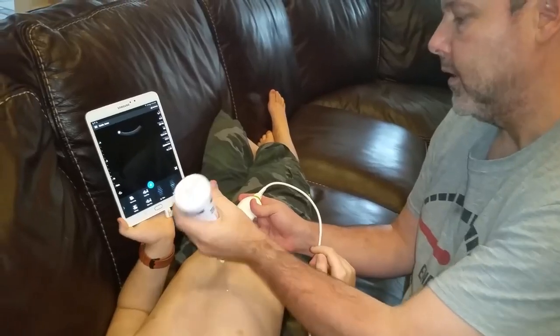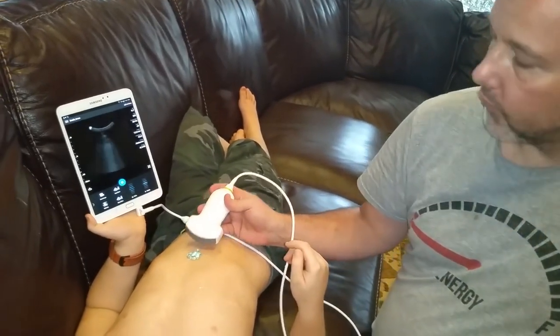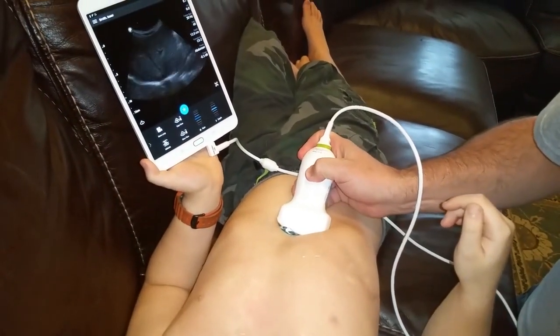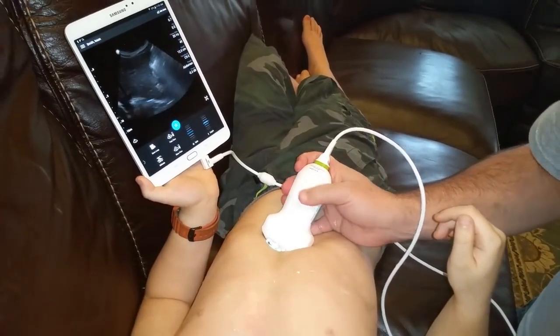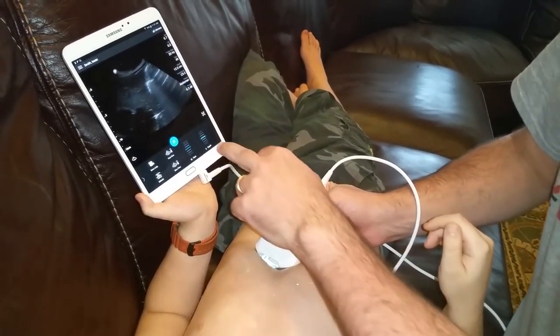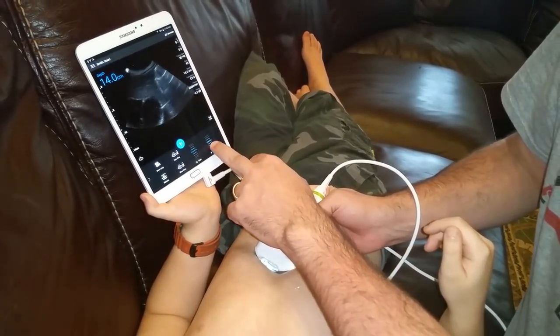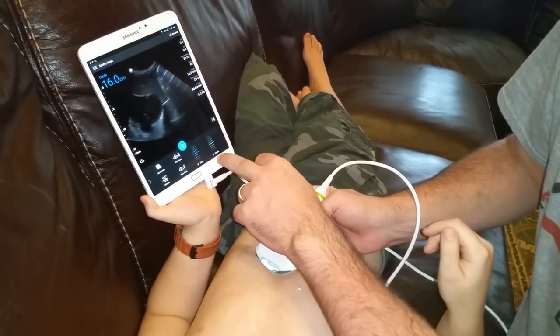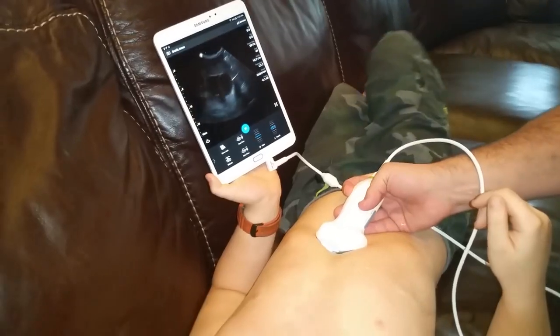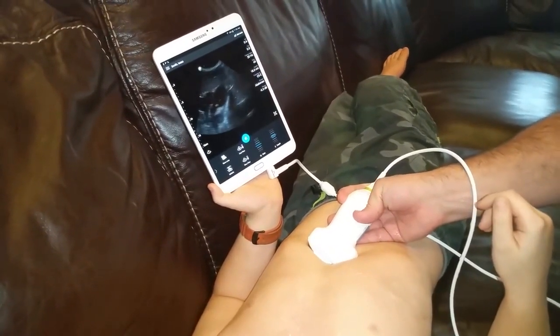If your images aren't good, you can always try to put some more gel on. So initially we're seeing a picture of the liver. My initial goal is to try and take a look at the heart here, and we can make it deeper by going deeper.